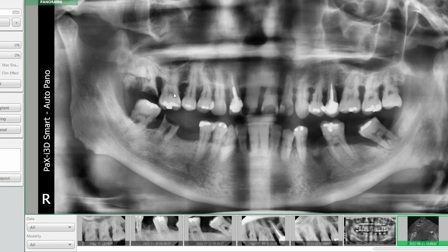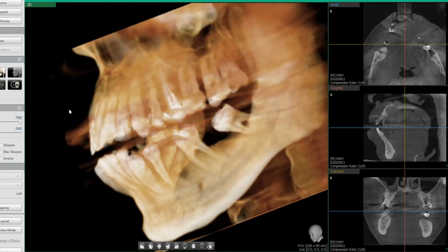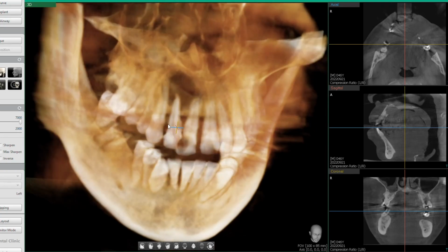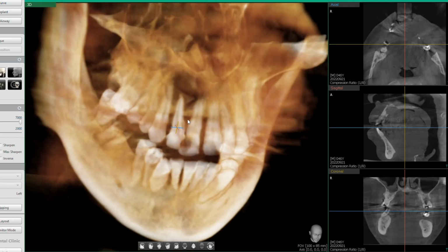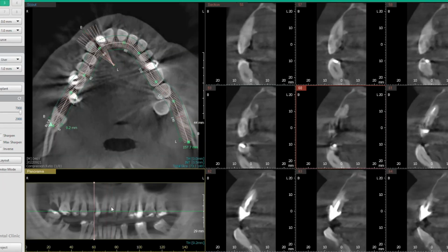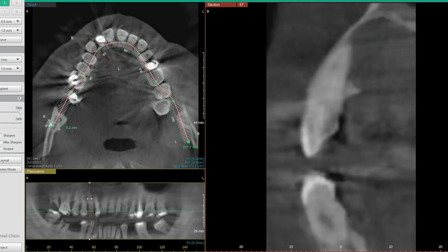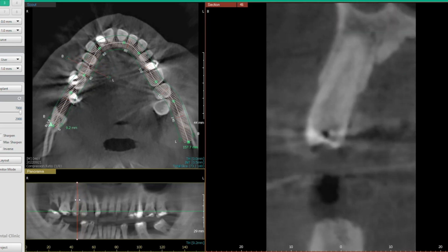So, this looks like a pretty easy case when you look at it. His sinuses, not too pneumatized, plenty of bone still left, even though he has periodontal disease, until I took a closer look. All right, so here's his 3D scan, and wait a second, what do I see here? There is a huge infection. So he does have a root canal tooth. Is it uncommon to see something like that? Absolutely not. He actually has a periapical cyst from his failed root canal.